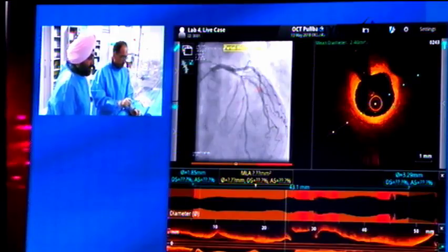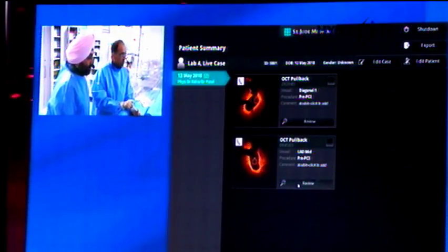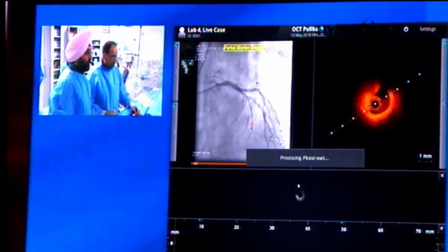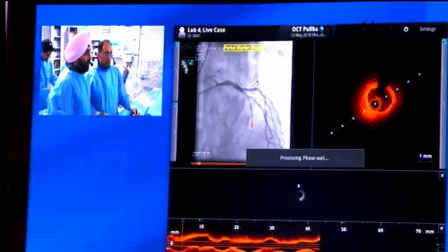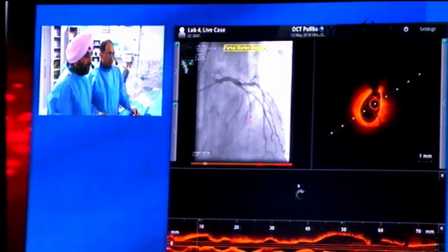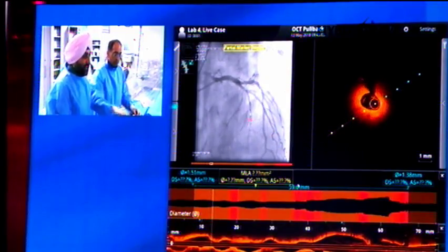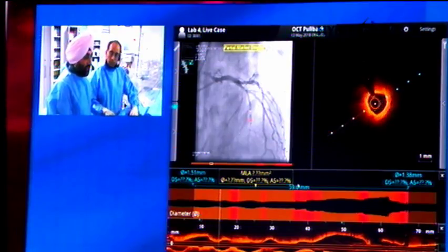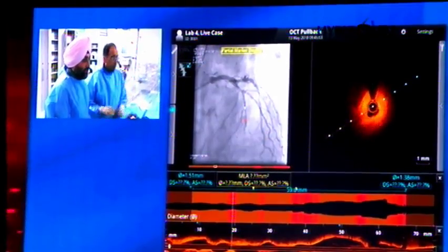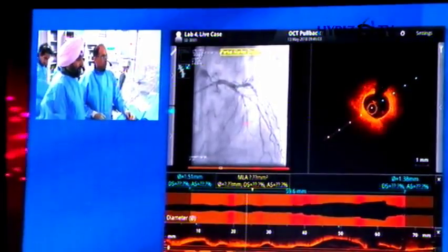Now, if I cut through from there, we're still on the OCT, and I'm going to go through to the LAD pullback. This is where the patient actually developed a lot of chest pain because the OCT catheter was obstructing flow down the vessel. So we got a little bit of an impression of what we were doing. Now, my normal practice, using the data from the Illumien trials, is to measure EEL to EEL to size the diameter of the stent that we're going to put in, and also use the longitudinal view to decide what length stent we're going to put in. So this is just playing in real time here.